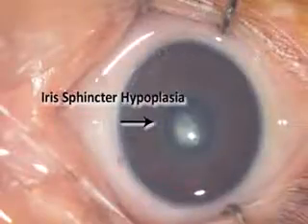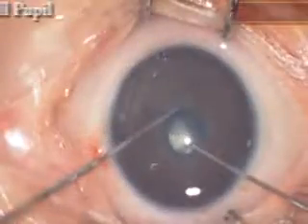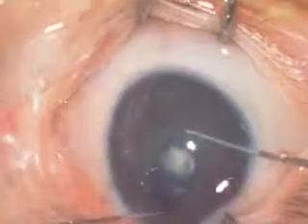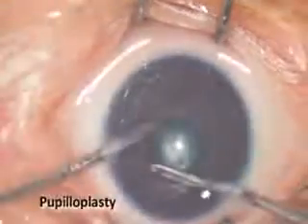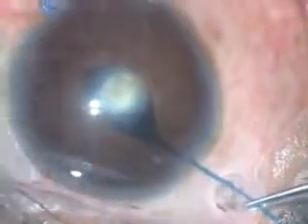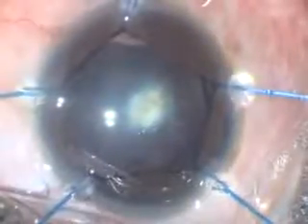The presence of iris hypoplasia in children less than 6 months of age is indicative of a non-dilating pupil, which is a typical presenting feature of rubella cataracts. Usually, the pupil cannot be dilated adequately by stretching the pupillary sphincter. Pupilloplasty using automated vitrector may serve to enlarge the pupil size. Remember that adequate dilatation with minimal surgical trauma can be achieved by using iris hooks.